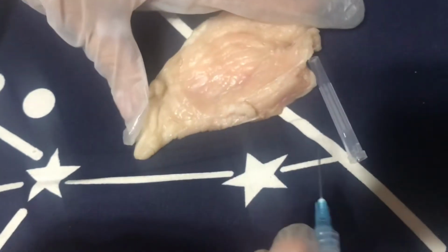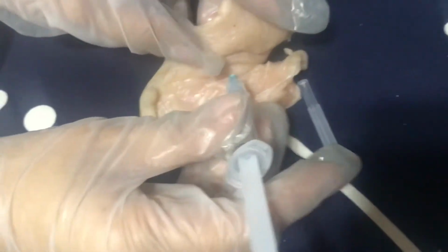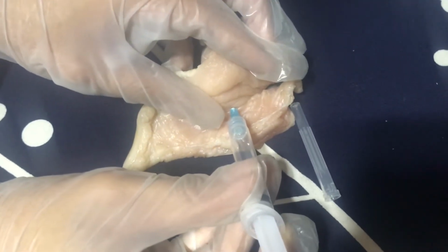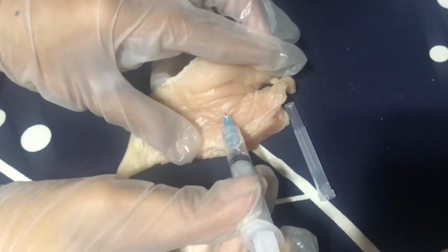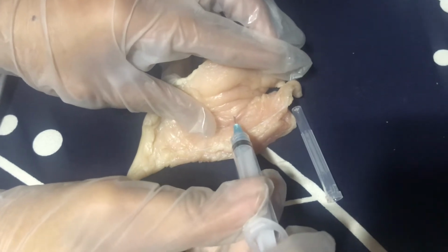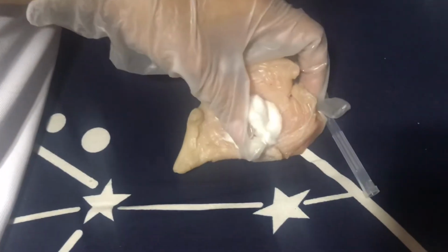So I will be injecting the medication slowly, at the rate of 1 ml per 10 seconds. Wait 10 seconds and smoothly withdraw the needle. I will be smoothly withdrawing the needle and release the skin and place a gauze pad on the site. Apply gentle pressure but don't massage the area. Place the client in a comfortable position.